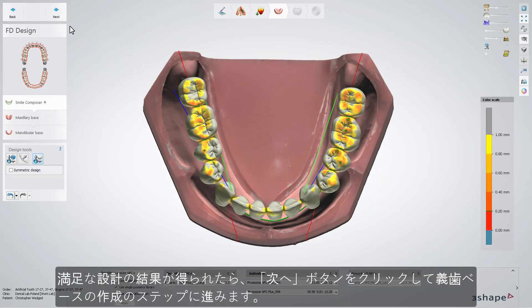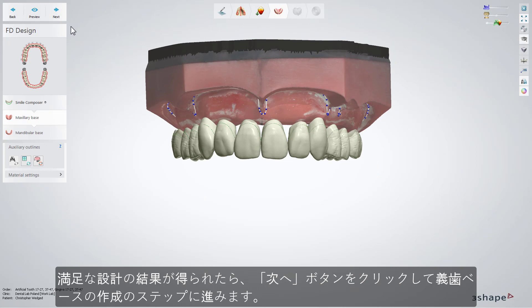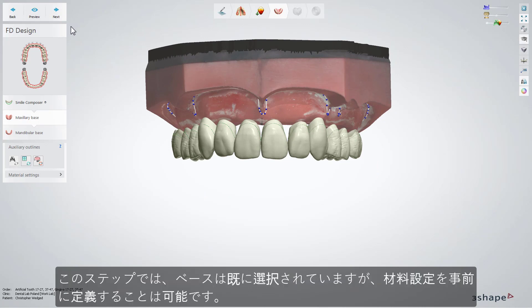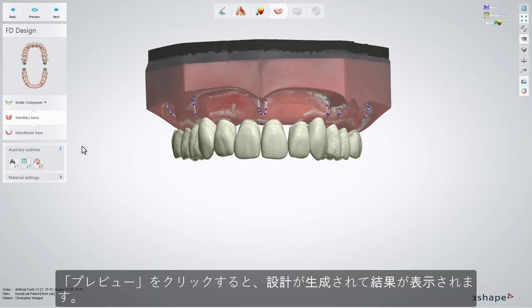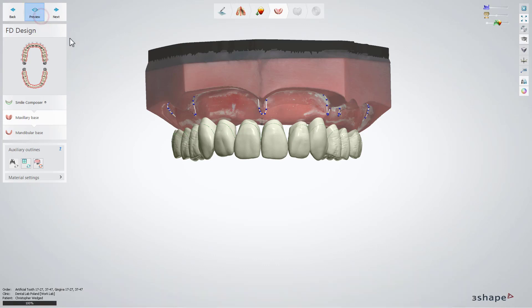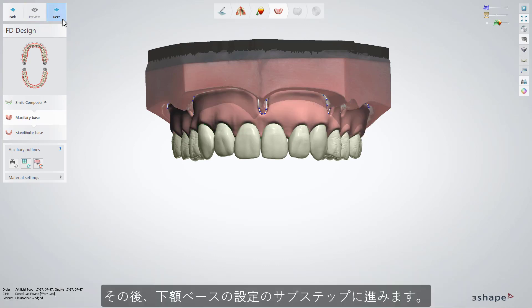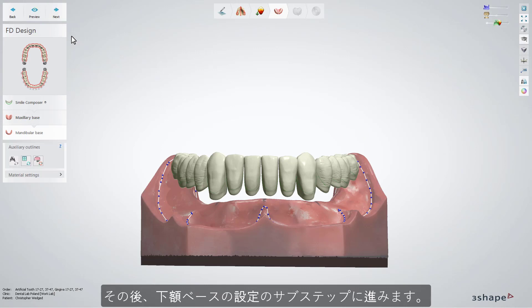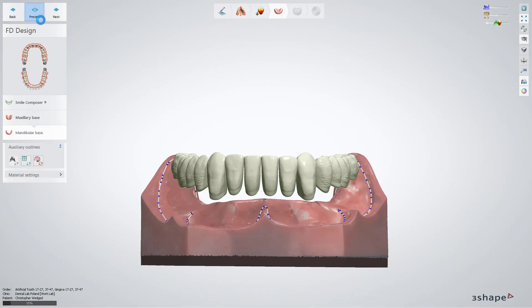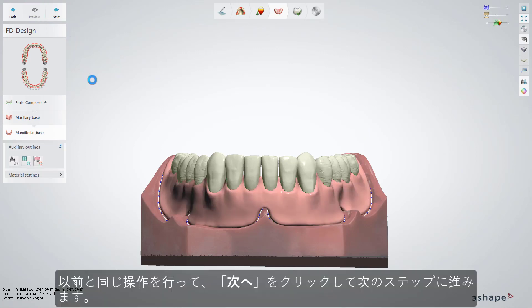If you are happy with your design, you can click Next and move further to create denture bases. The base was already selected; however, we will still have the possibility to pre-define the material settings. To generate the design, choose the Preview button. After that, you can move to the Mandibular Base sub-step. Do the same as before and click Next to move further.